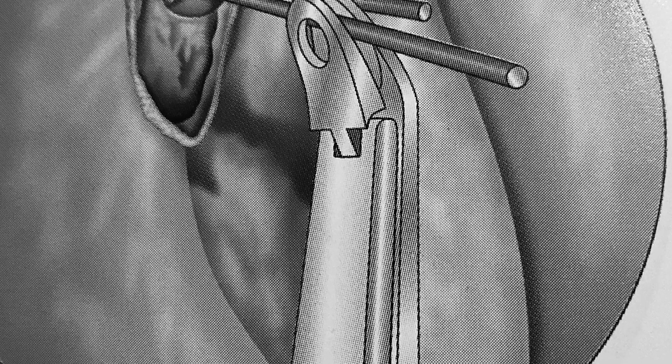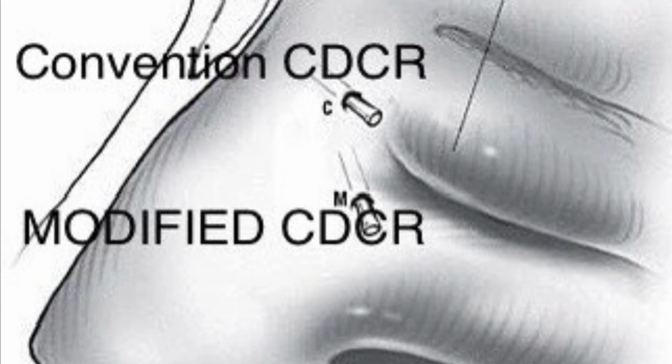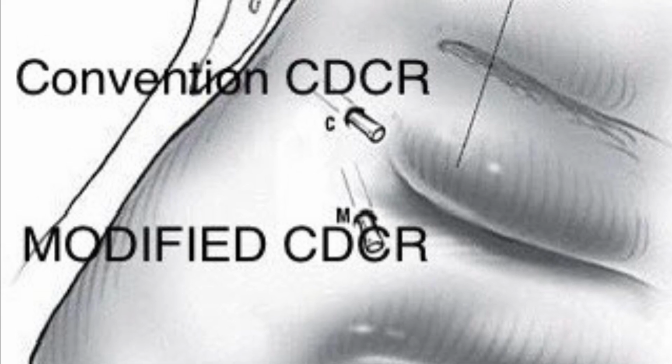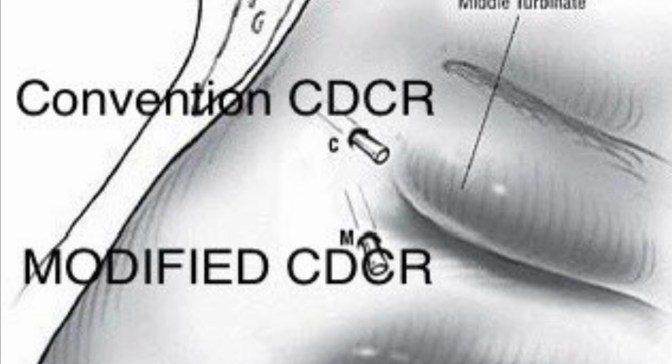Once the catheter penetrates the lacrimal sac and lateral nasal wall, it is identified intranasally with the aid of an endoscope. This visualization ensures that the catheter is appropriately placed and not obstructed. It is vital to guide the catheter anteriorly to the middle turbinate to prevent it from becoming lodged against the turbinate surface, which could compromise the procedure's success.